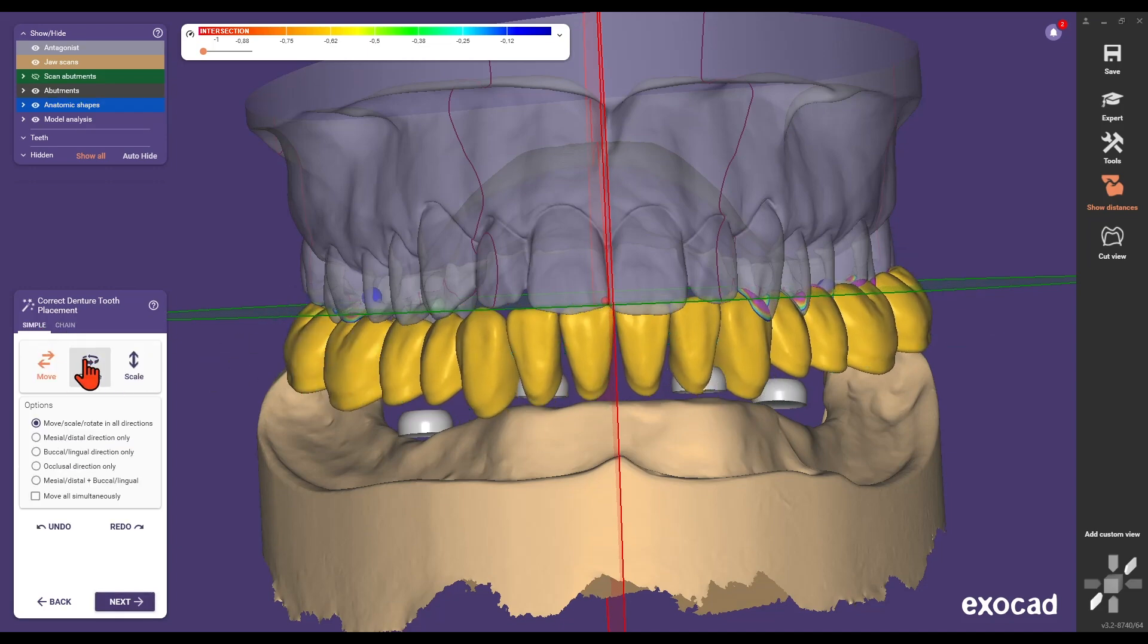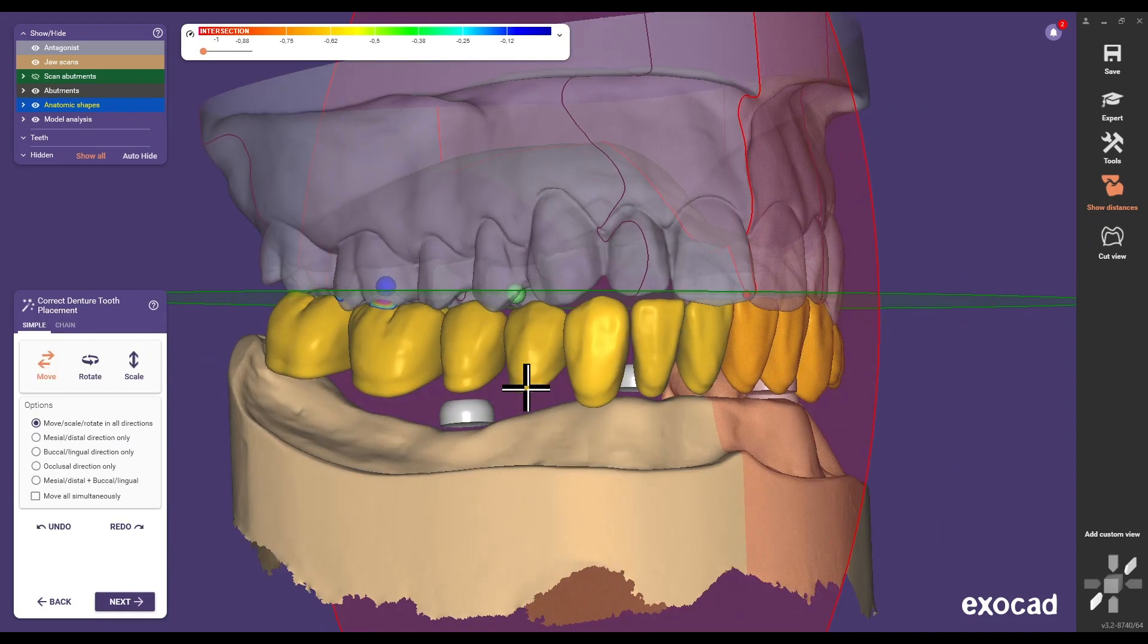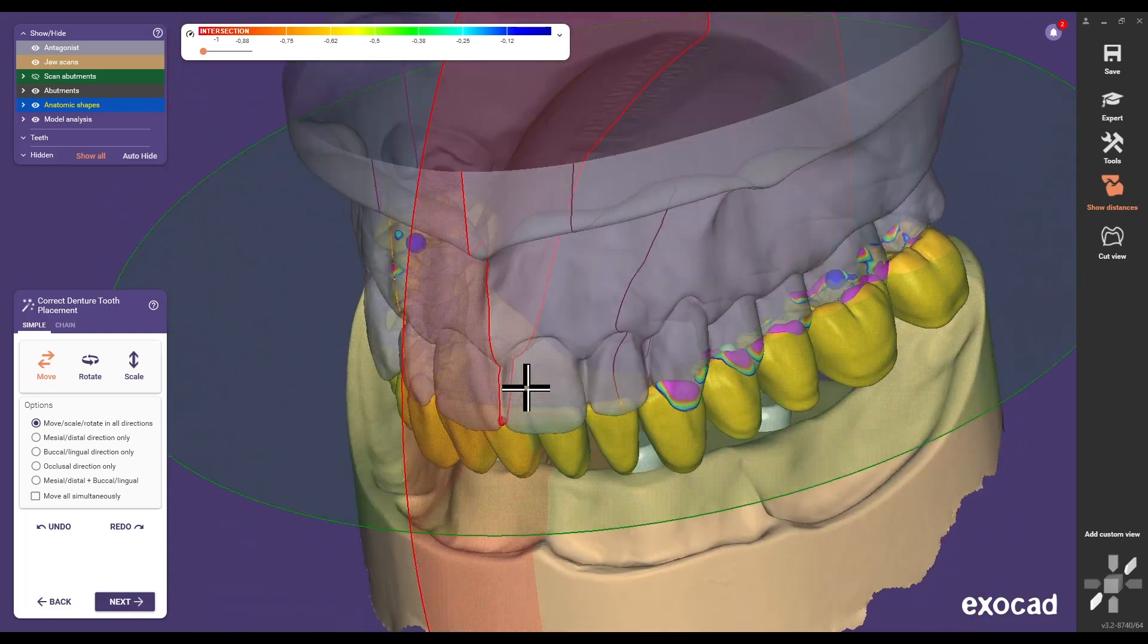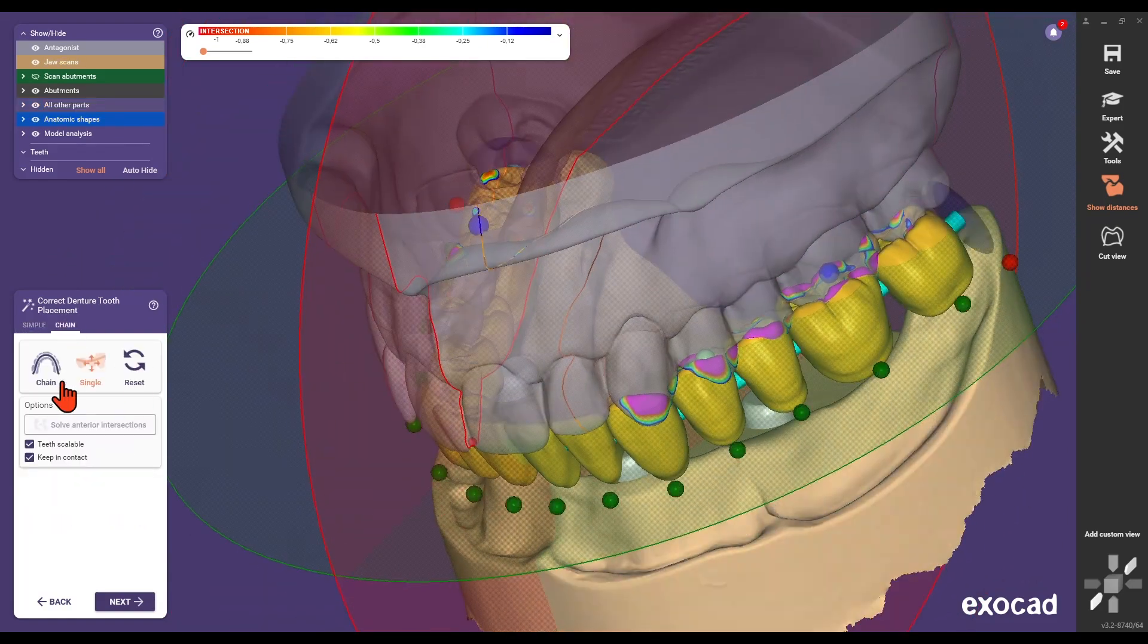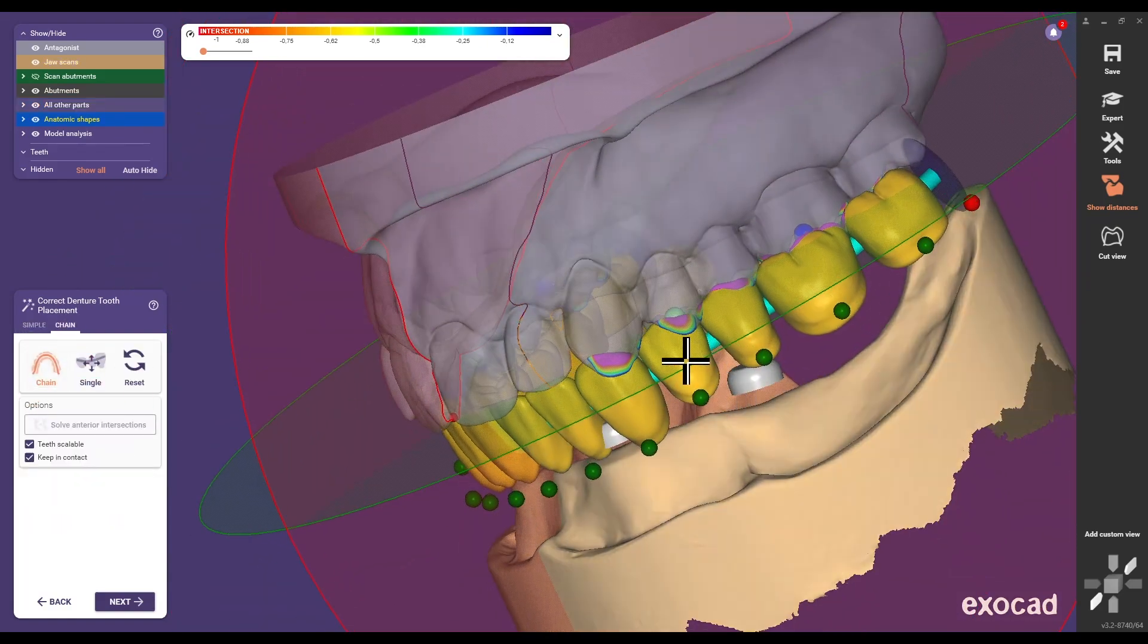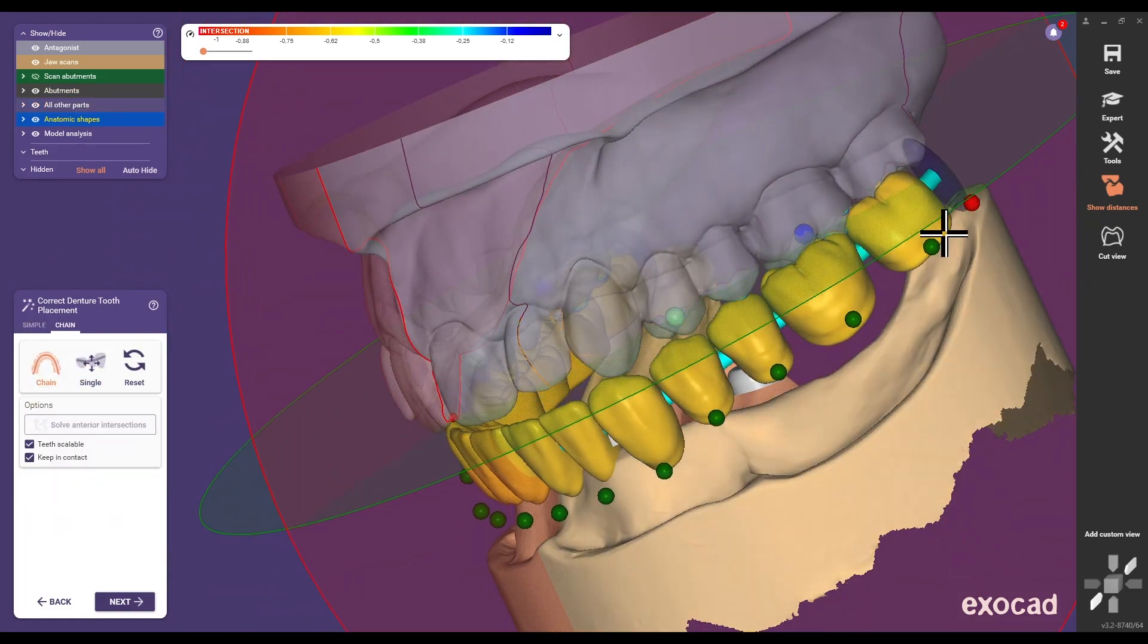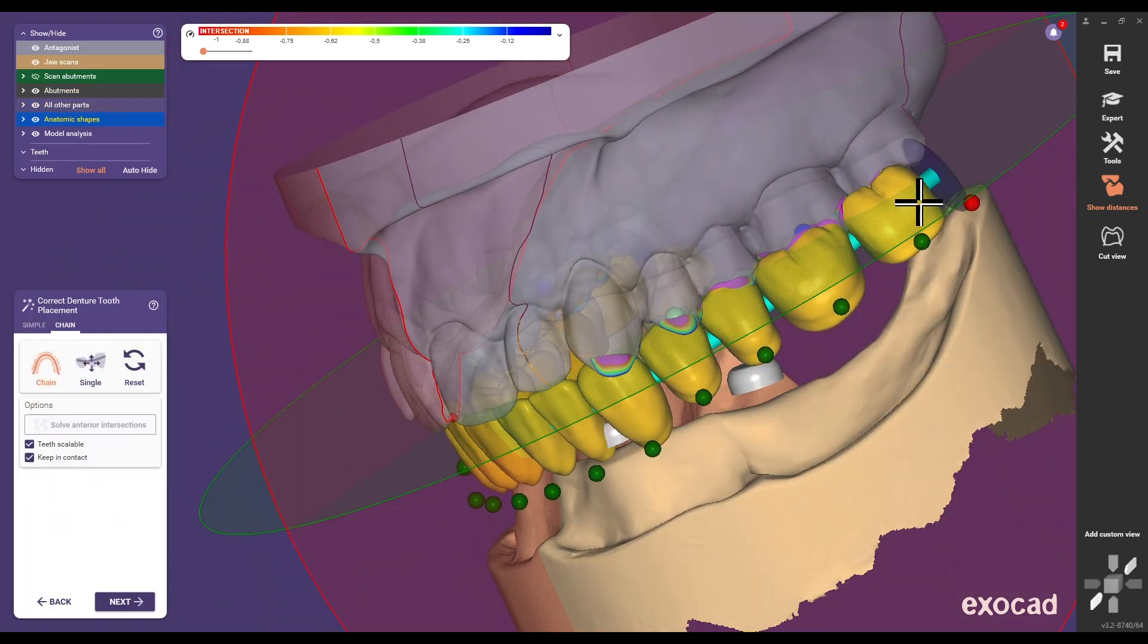For more detailed adjustments, use the correct denture tooth placement step to rotate and move teeth individually or in a chain.